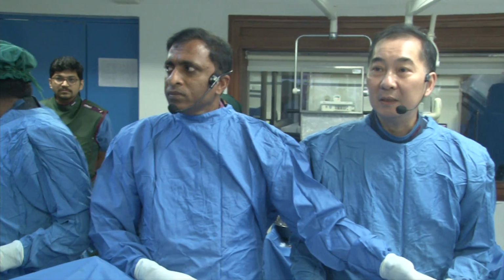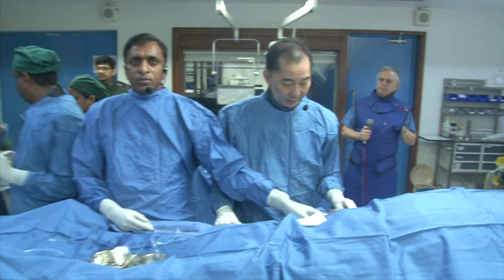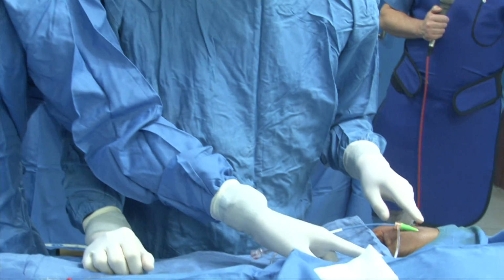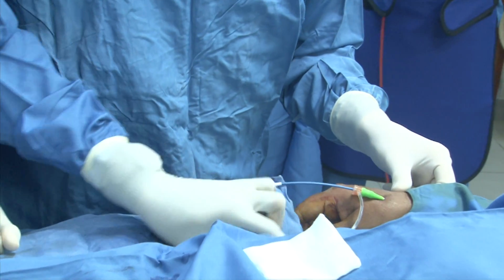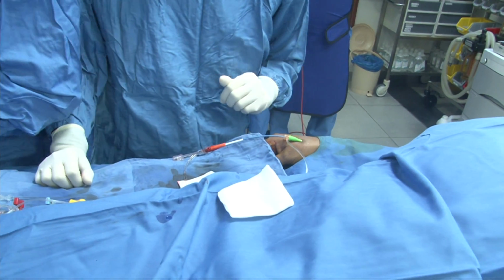So this is a JR4, and we go through the distal radial artery. I think this one is punctured really well. Everyone can see that? This is a 7 French slender sheath, so it's no problem, really easy to go in.